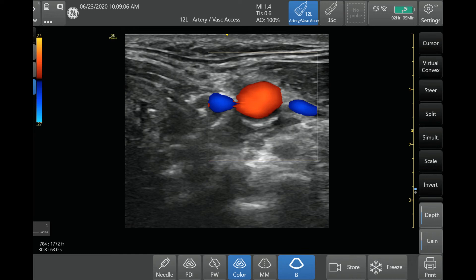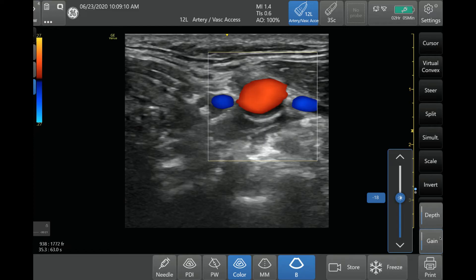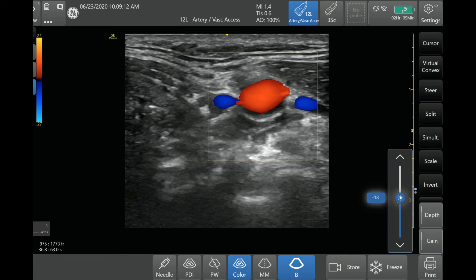The next thing you can adjust is the color Doppler gain. This is the gain button here. When you're in color Doppler mode and you push the gain button, that will change the gain of the color Doppler, not your grayscale gain. It won't change the actual brightness of the gray-black area — it'll change how much signal you're actually picking up from the color Doppler itself. Keep that in mind when you adjust your gain settings in color Doppler mode.